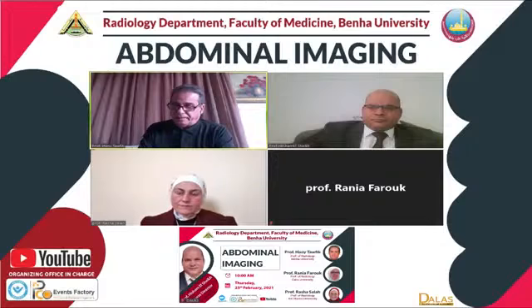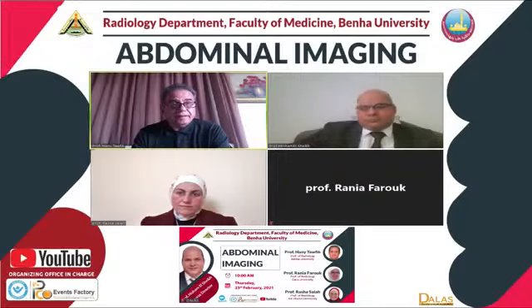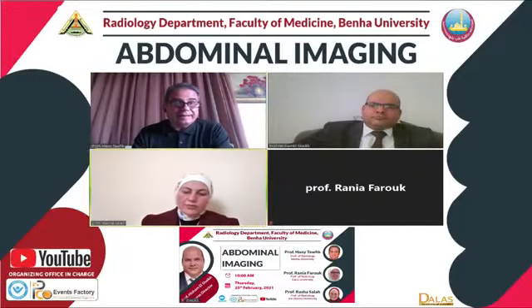فده تعليق يعني، لو برضو بيبقى الأشعة oriented بالتقسيمة دي هيكتبها في التقرير بتاعه وهو شايف قد إيه التيوب. السؤال بتاعي بقى، احنا بيجي لنا عيانين يعني advanced، وبنفتح العيان نلاقي عشان نعمل حتى palliative resection ما نعرفش، لأن بنلاقي frozen pelvis وperitoneal nodules all over the peritoneum وشوية minimal ascites كده. هل في modality تشخص لي الحاجات دي عشان ما أفتحش العيان أصلا؟ أنا أفتحه وأقفله، هذا خلاص metastatic peritoneal nodules اللي هو carcinomatosis peritoneal all over the peritoneal cavity، أو حتى في بعض الحالات لو حاجة بسيطة ممكن يتعمل، أبقى مجهز له HIPEC.